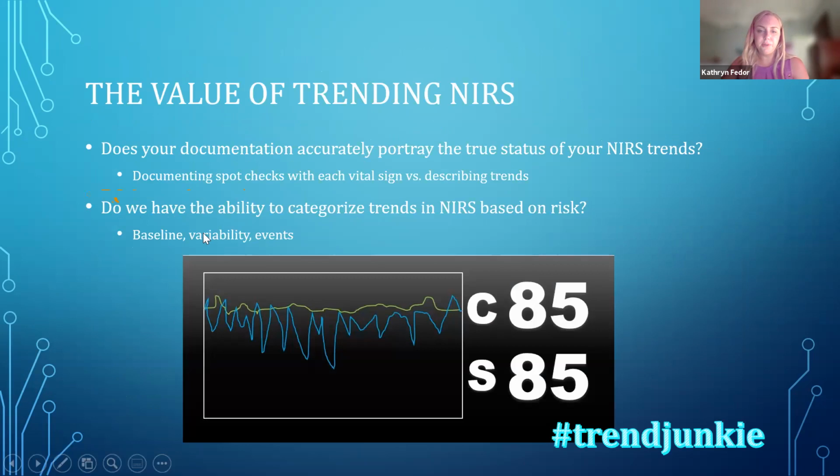So, we keep asking ourselves, and we continue to ask this question of our medical team, our quality team, and our research team, can we come back to NIRS and can we use trending in all aspects of our documentation and our assessments? Certainly there's a lot of us that are really eager to get NIRS on these babies, and we know that it's trying to tell us a lot.